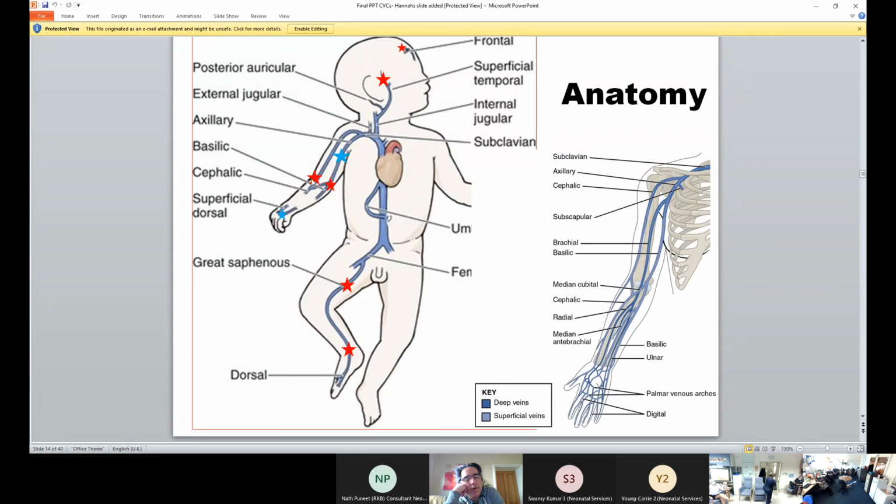There is also the cephalic vein, which runs along the lateral side of the arm, you see. But the problem with this vein is it's narrower than the basilic and has a sometimes tortuous course, and it has a longer course. So it is a second choice. So if you can't do it here, you can do it there.